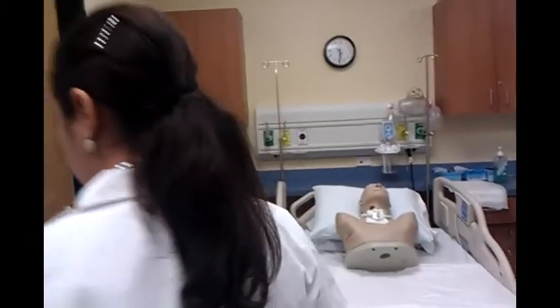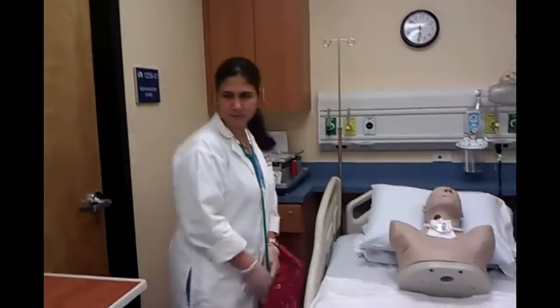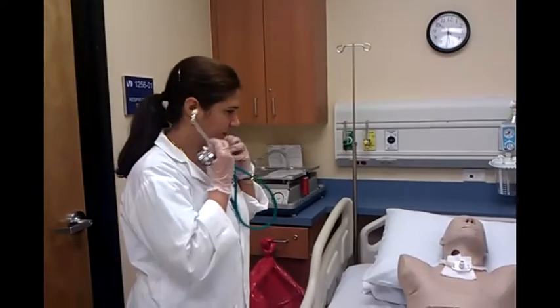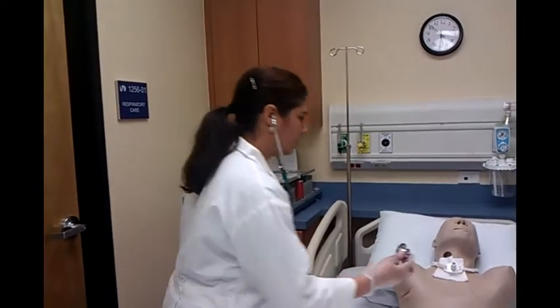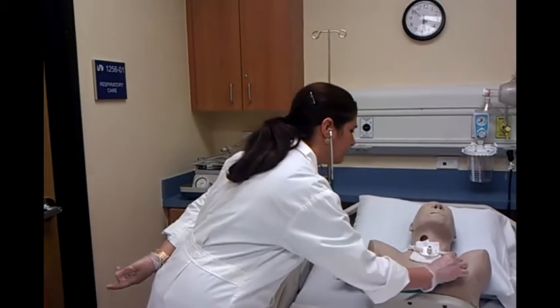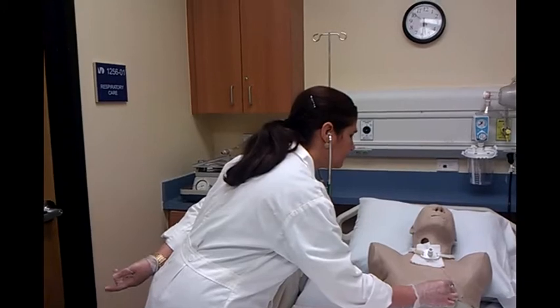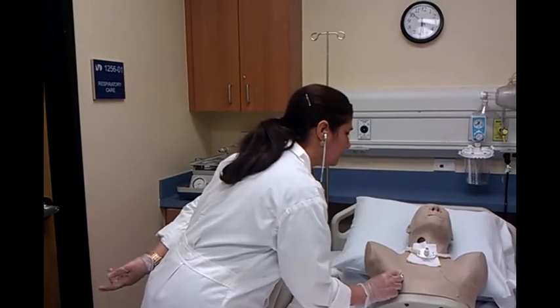I'm going to go to the other side. It's more comfortable for me to work. Also, I have the trachea care kit over here to do the trachea care. Take a breath. Take a breath.